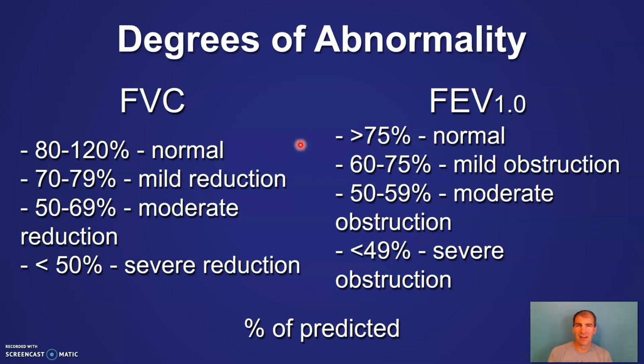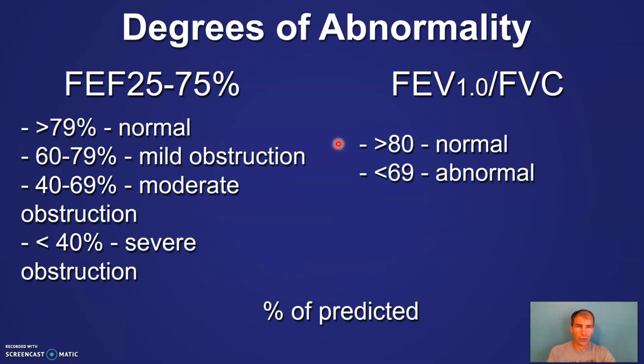So if you're 95% of normal, that's normal. That's key because when we do this in lab, not everyone's going to be perfect. Some people will be above normal, some people a little below normal, but all of that really is in the whole category of normal. Same thing with FEF and FEV1. Again, usually it's not until we get to 70% of normal that this really becomes an issue.